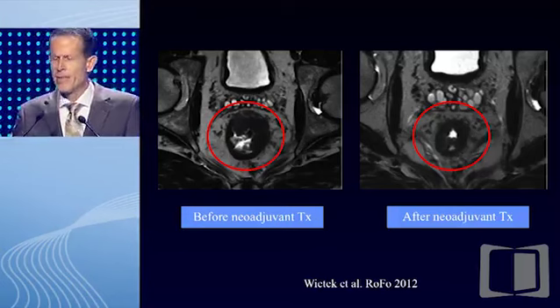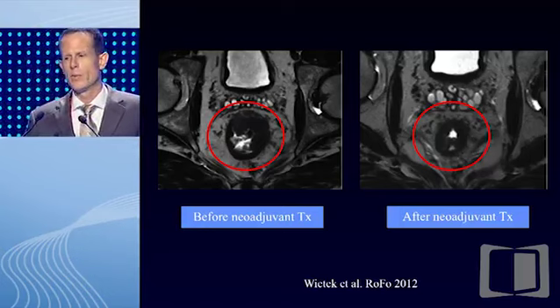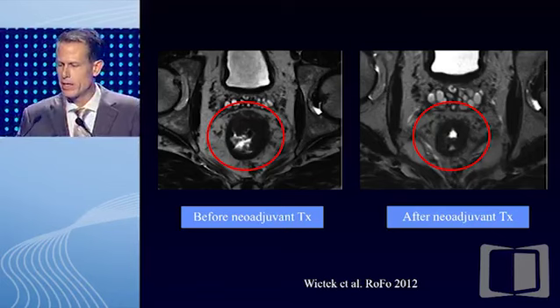The next step then is when we use morphology, and we've heard about the size criteria when we do some form of therapy, is to measure sizes pre and post therapy. Like in this patient, as you can see, left-hand side, there is the status before therapy, and right-hand side, the status after therapy. And I think here it's pretty obvious. There is shrinkage in the tumor, the size of the tumor has diminished, so we can pretty well conclude that the therapy was successful to some regard. But is it always like this? Of course it is not.